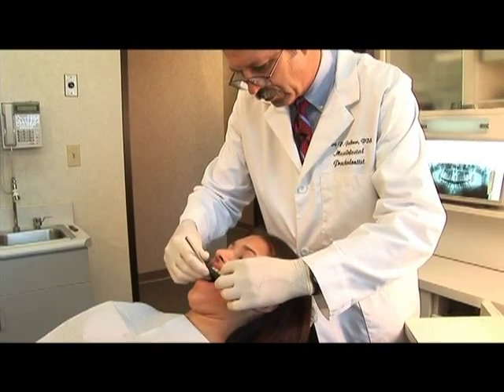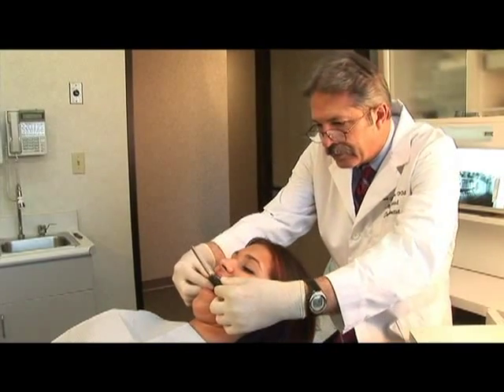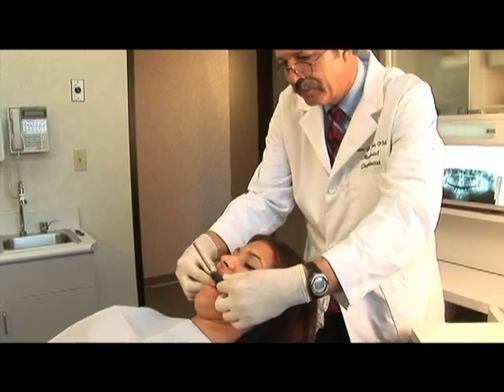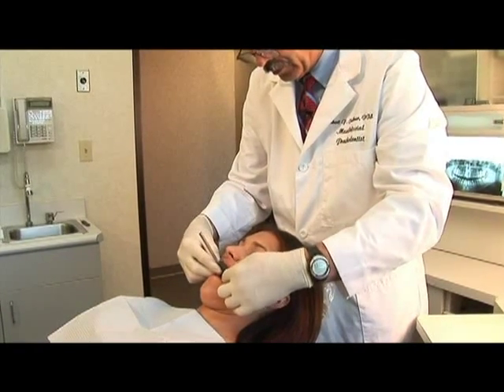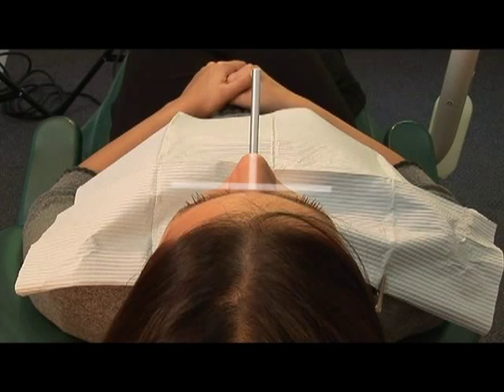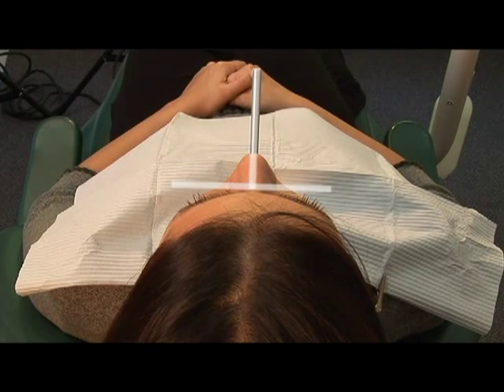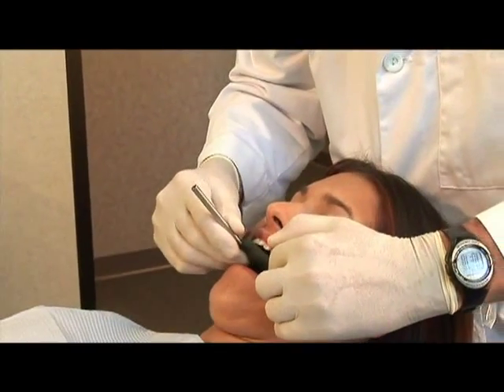Position the fork so that the stem of the fork aligns with the facial midline and support the fork until the material is set. The best way to check the alignment of the bite fork is to view the patient from behind. Note how the stem of the fork is aligned perpendicular with the facial plane. When the material is set, gently remove the fork.